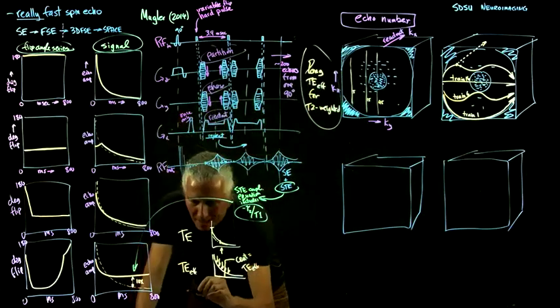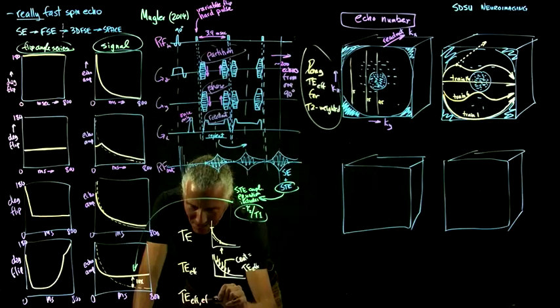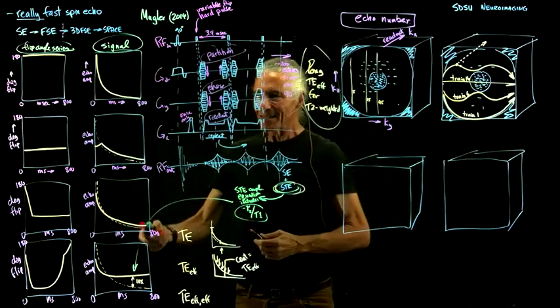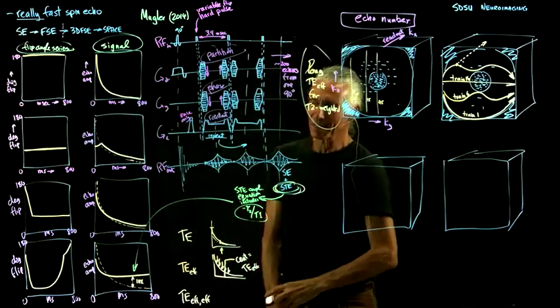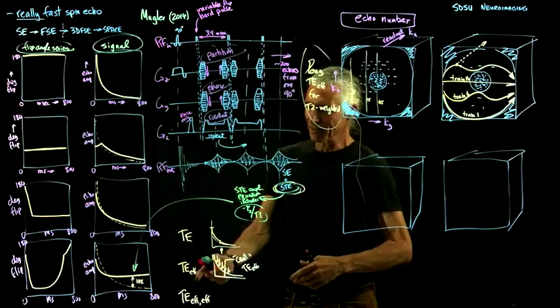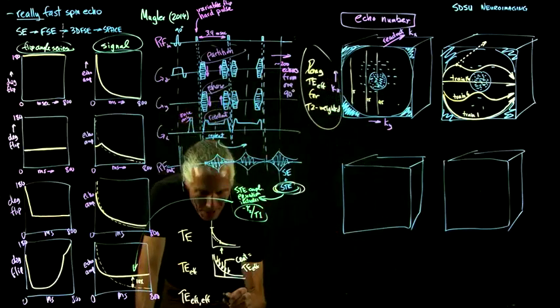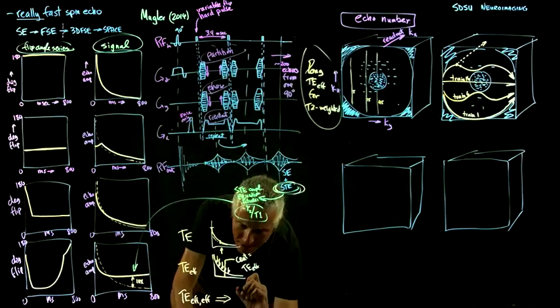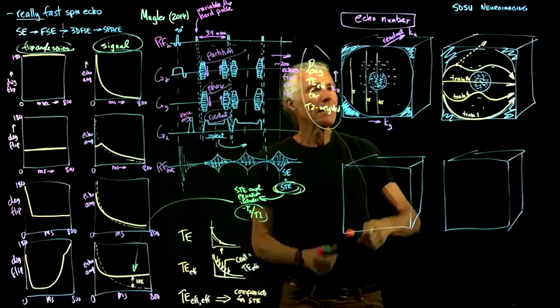But now we have TE effective. And so what is that? Because we've done all these stimulated echoes, the echo train lasts 10 times as long. And so by the time we actually get to the center of k-space, it might be like 300 milliseconds or 400 milliseconds. And so that's supposedly the TE effective, but it's not really. It looks like a TE of like 50. And so what they do is they put a much smaller number, to essentially compensate for the stimulated echo, or STE.